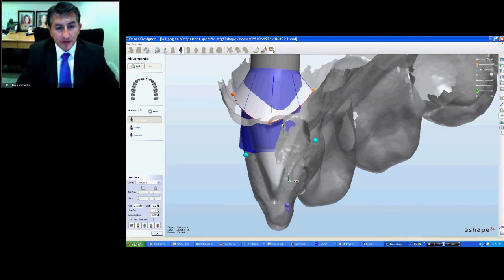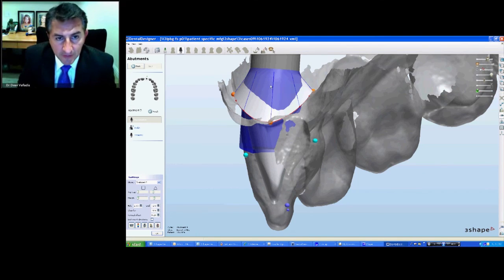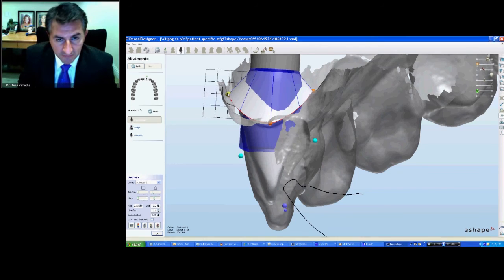So when we're doing our designs of our abutments, you can see here on the video that we're going to use the 3Shape software and change the mesial and distal contour, as you see here on the video. As it changes, you can imagine that the tissue will respond differently. So a deeper shoulder or a longer shoulder will change the design process of the final abutment.